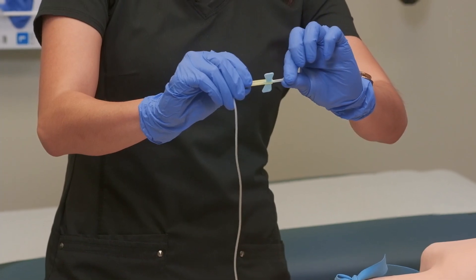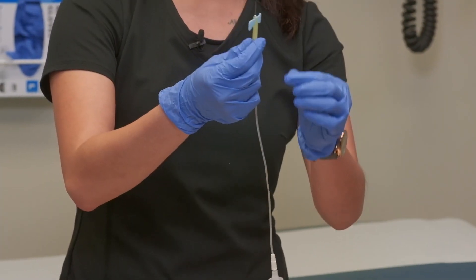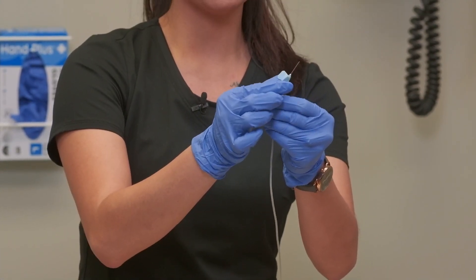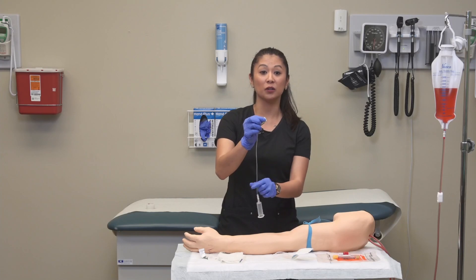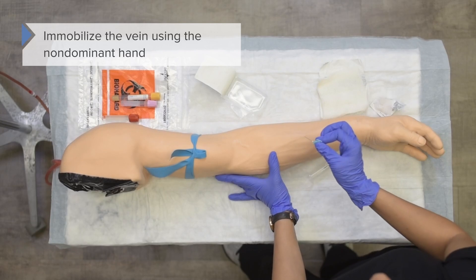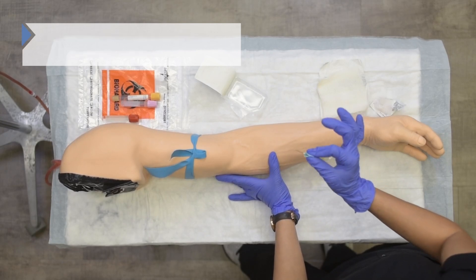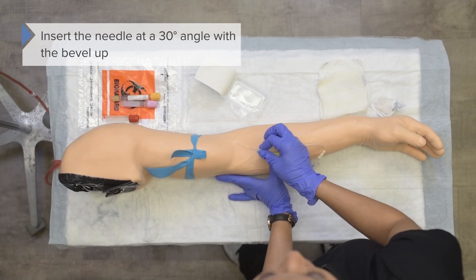Pull the plastic part straight out. These needles have little wing devices that I like to hold on to for the insertion of the needle. Once that's done, I can immobilize the vein using my other hand. With my dominant hand, I'm going to insert the needle with the bevel up.